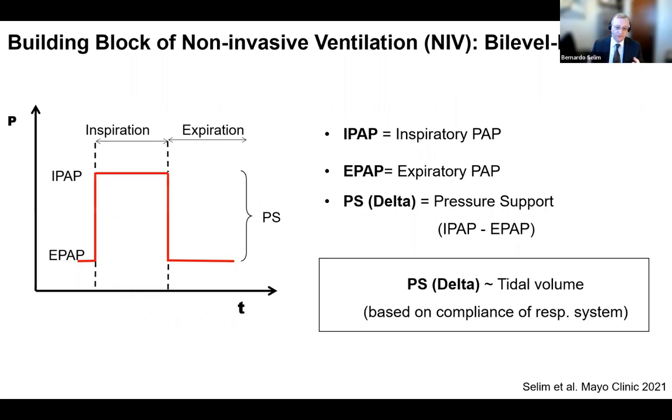So most of the time when they come and present a case to me about a need for ventilation of a patient, they come to me with the settings. And they tell me, well, my patient is on an IPAP of X and an EPAP of Y. And the most important information is what tidal volume, what minute ventilation that translates to.